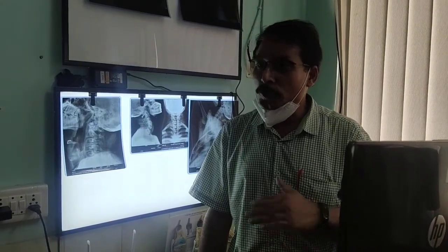So these are the X-rays, and then we also talk about the oblique views, right and left oblique views. These are also X-rays used in trauma situations. But I told you also that even after doing all these things, sometimes you may not be able to give a very good diagnosis. But our endeavor is always to avoid any misinjury of the cervical spine. That is why you take all the X-rays as necessary, that is one point. Number two, it is also necessary to go for further investigation by cervical spine CT scan or MRI to look particularly at the ligamental complex and the status of your intervertebral disc.